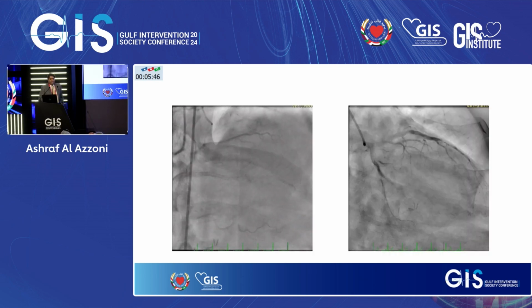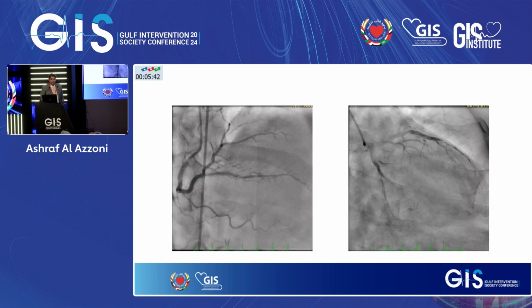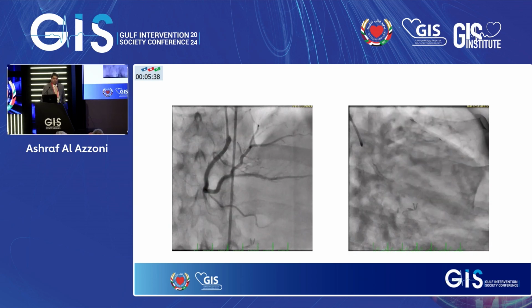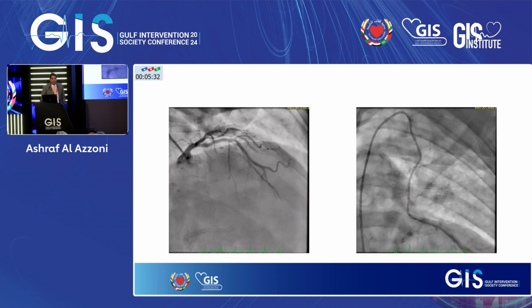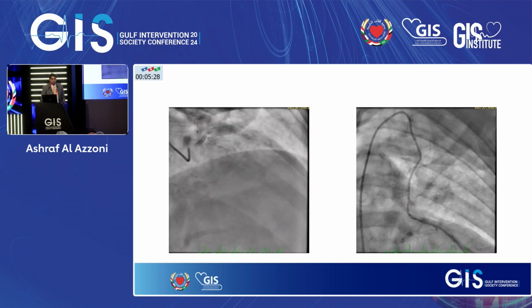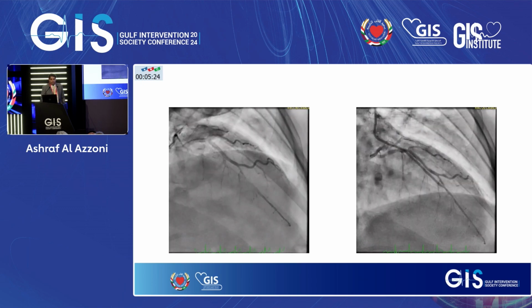So we did the cath for him, and essentially the right coronary artery had stents all the way to the PDA that were all patent. The circumflex had a stent that had some disease at the distal edge into OM1. The LAD had disease in the mid part just before the anastomosis with the LIMA, and the LIMA itself was patent.